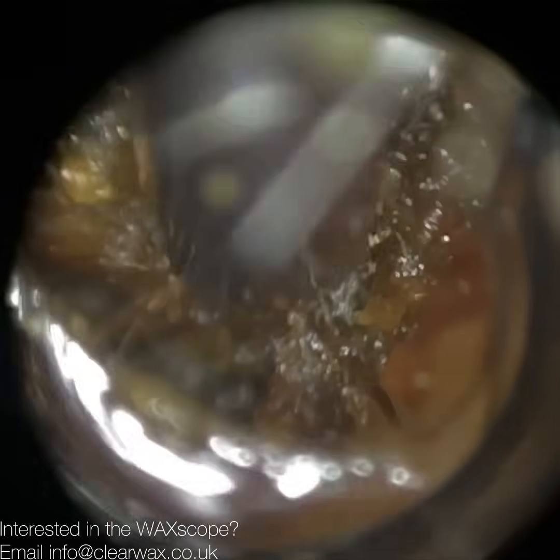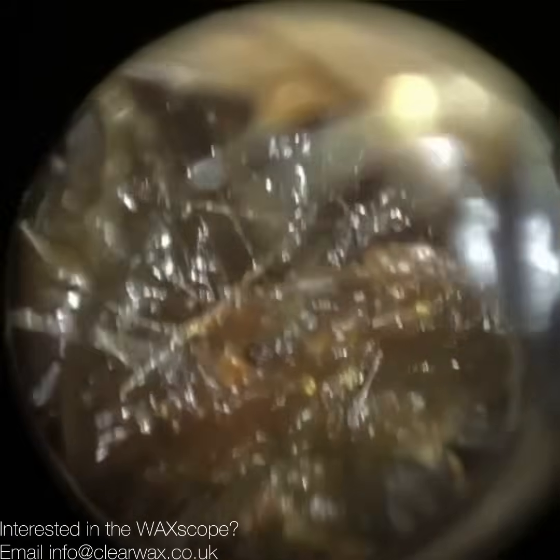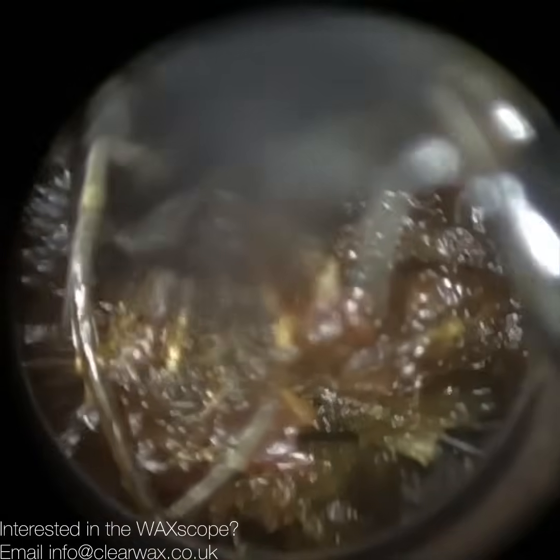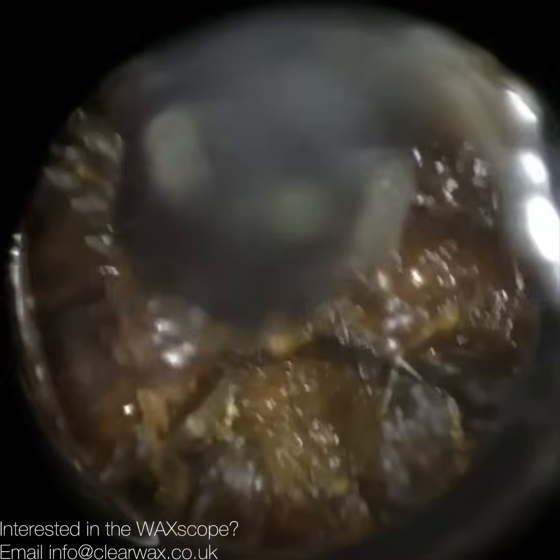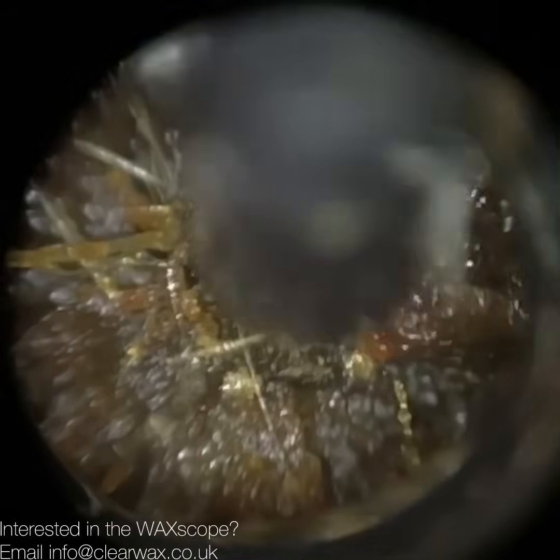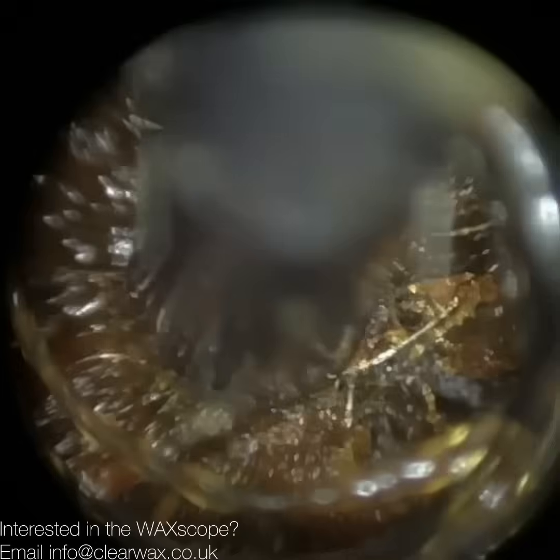But here it's right up against the eardrum, and it's really compacted, and I've just put a lot of oil in here, just trying to loosen and change the consistency of this wax plug. So the speculum size I'm using is a 4.25 millimeter speculum. I'm using this more and more. Initially with the WAXscope I was using the smaller specula because it's got an opening at the roof, which is a necessity when you're using a device like this. If the suction probe went right through the center of the speculum, which would be the case if you don't have an opening, then your view would be obscured by the suction probe, the lens being directly behind it, and you wouldn't really be able to see what you're doing, or what you are visualizing is very distorted and lacks clarity and definition. So you're having to have that slit at the roof of the speculum.